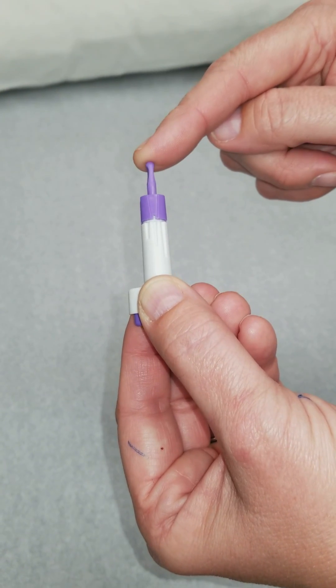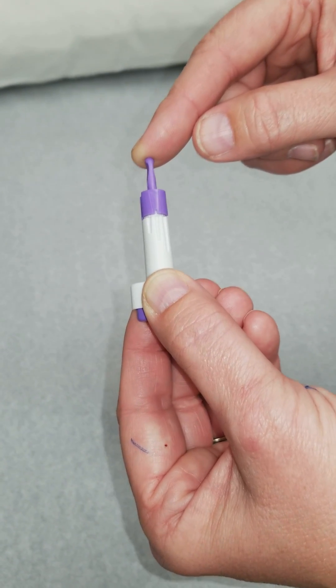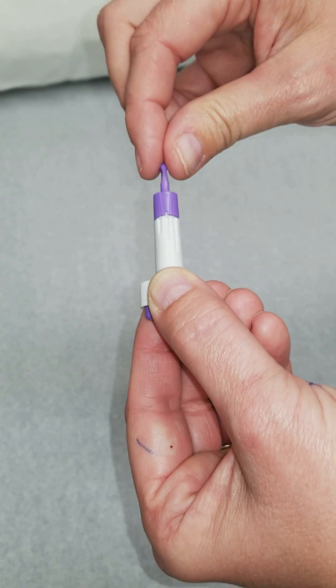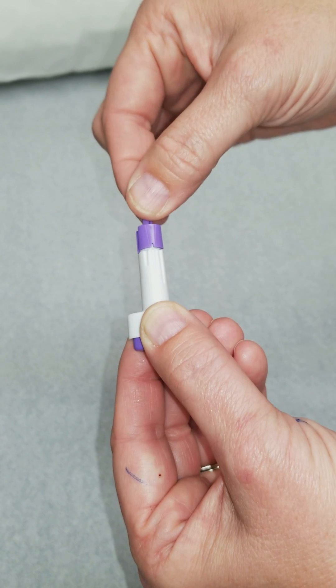This right here is just a little stick that is protecting the tip. To remove this, you do not pull — it will not come out with pulling. First you have to twist, and after you've twisted it, then you pull.